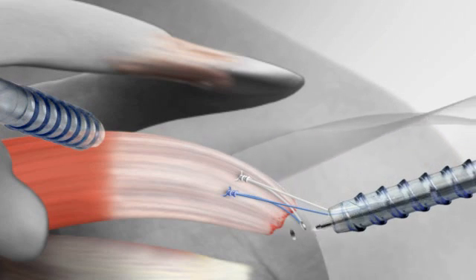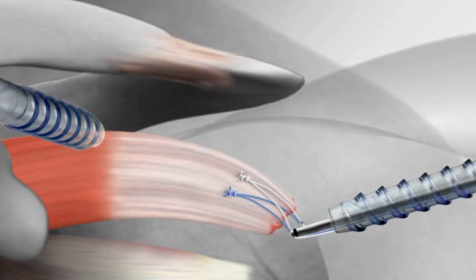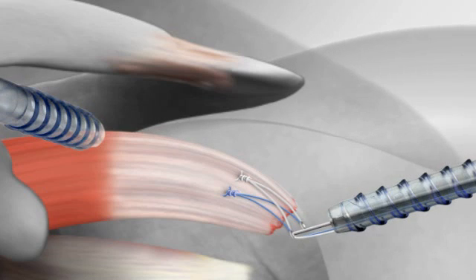The double row rotator cuff repair is complete when both sutures are securely fixed to the bone in all four sockets.